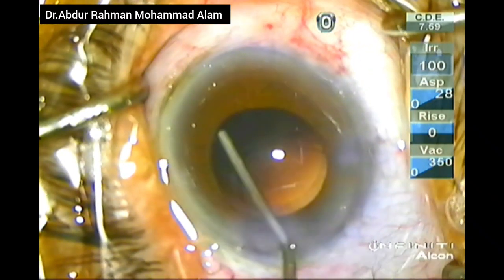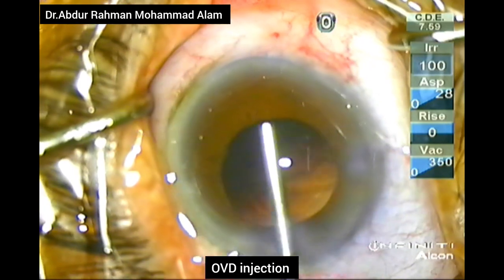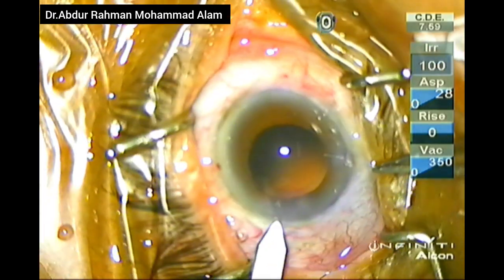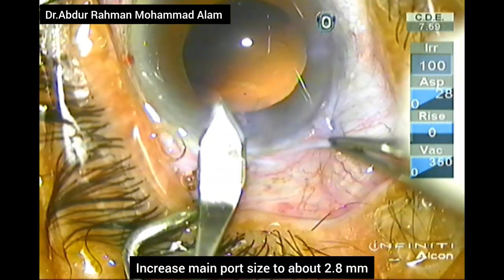I am giving adrenaline again to cause dilation. OVD is again given to deepen the AC. Now I will increase the incision size from 2.4 to 2.8.